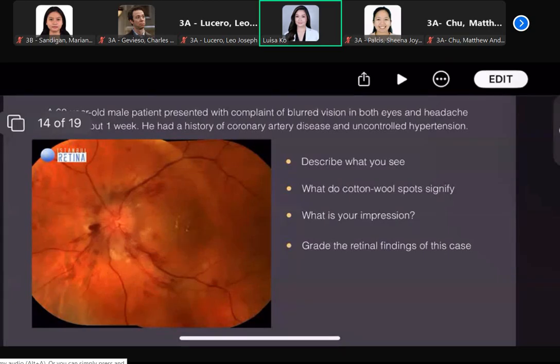No, it's blurred. So normally you can't really tell it's edema in a two-dimensional picture like this, but when you're looking at the patient in actuality, in direct or indirect ophthalmoscopy, you will see that the retina is kind of elevated. So in this case, we have some visual cues that there is macular edema. Number one, because there's loss of the normal foveal contour. And number two, because there are hard exudates in that area. Okay? What's our impression in this case?